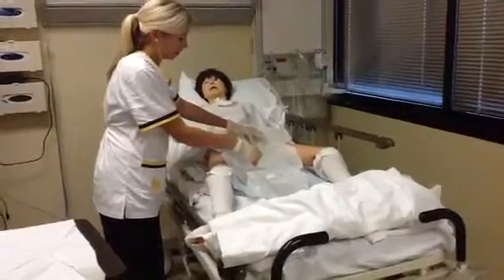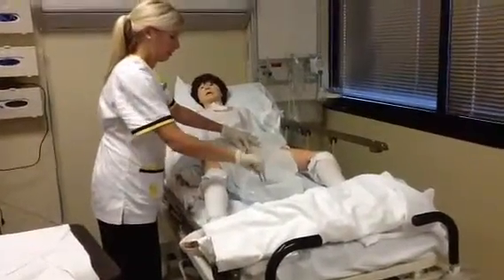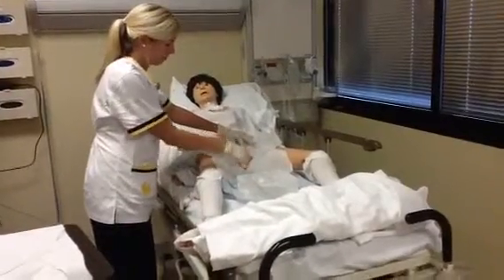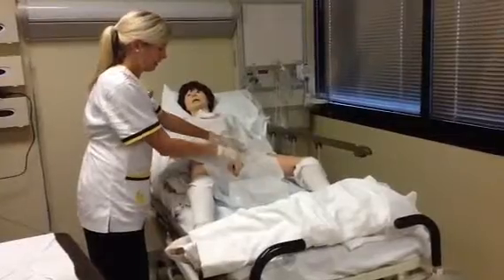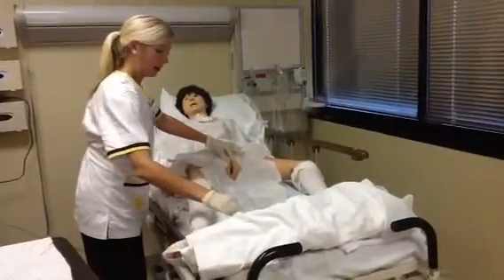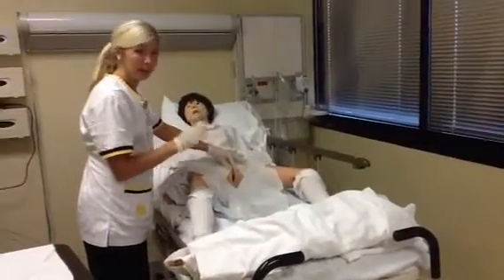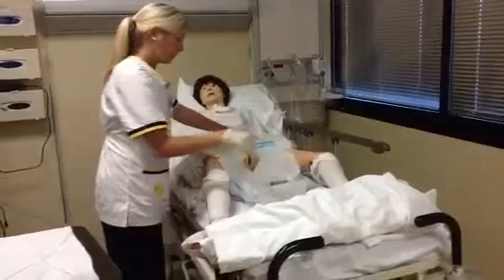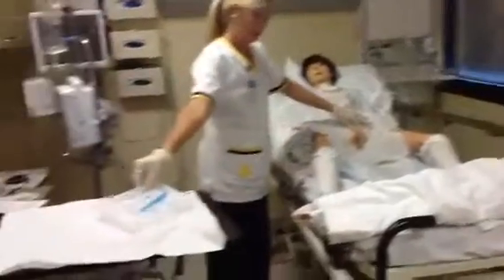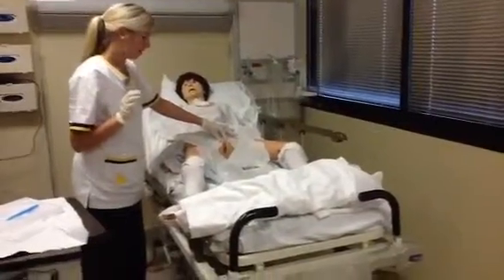Outer again, clitoris to anus, inner, middle. Okay, again, I'm going to keep my non-dominant hand on here the entire time until my sterile procedure is over. Now that I'm done with this, I'm going to move this over here. Again, not turning my back or reaching over my field.